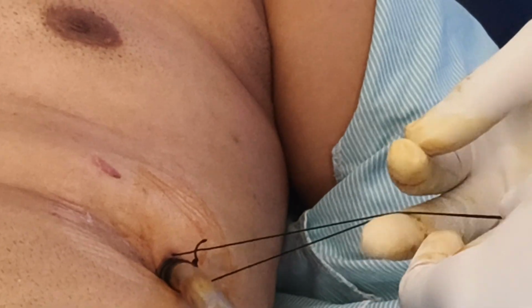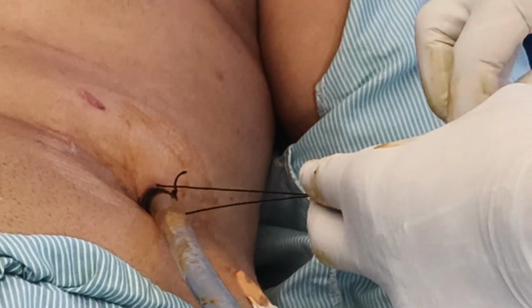So they have been tied together. So I will just separate them, because I have to tie a knot.